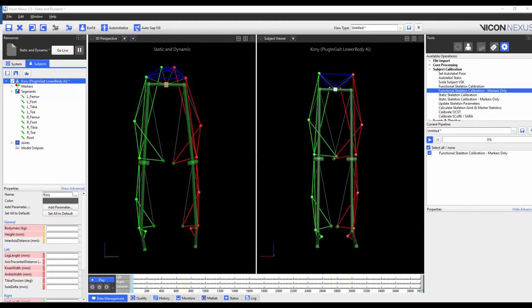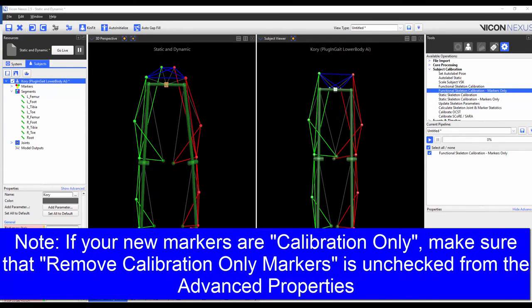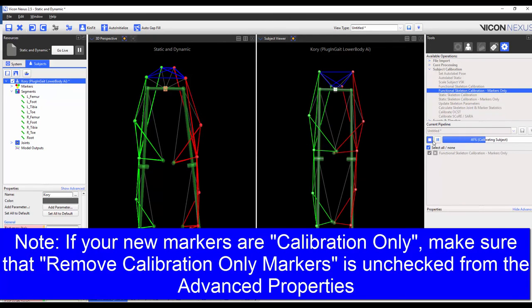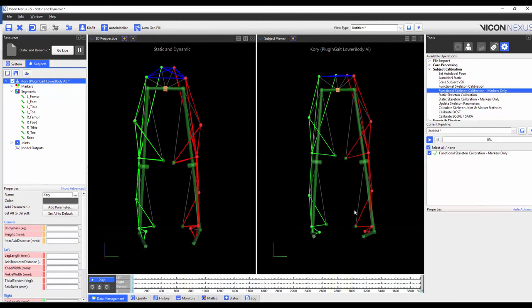I've chosen the markers only functional calibration because I want to keep the joints in the same position but to reposition the markers around the joints. When this operation is complete, we will see the markers correctly align.